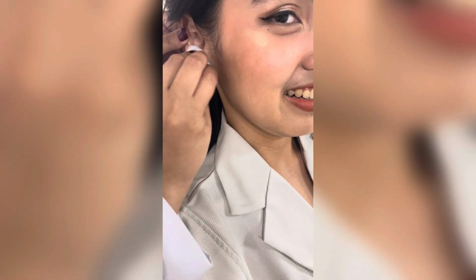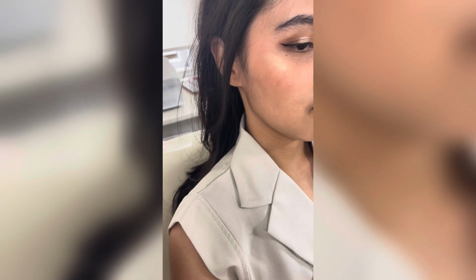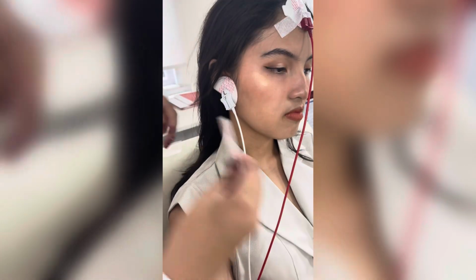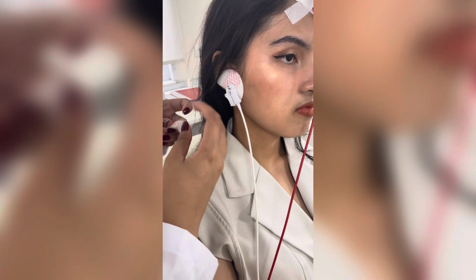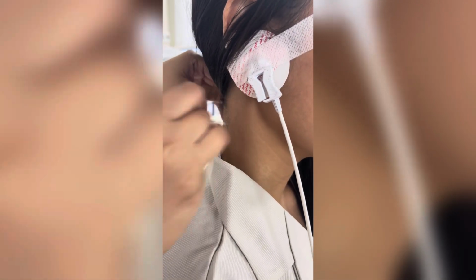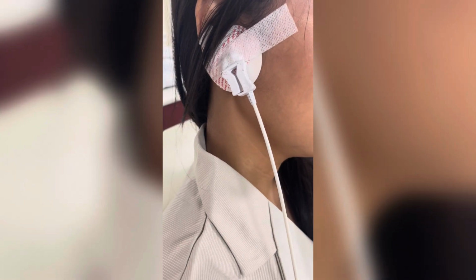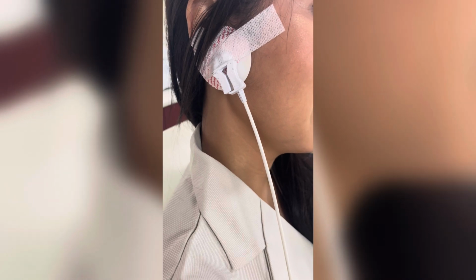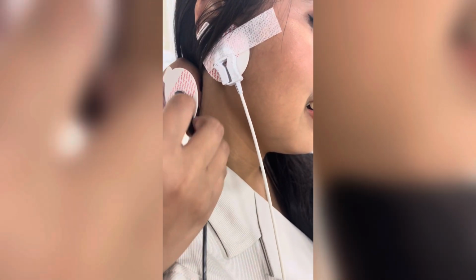And then the location of the second electrode, which is the reference electrode, the white one, is going to be placed on the underside of the earlobe of the patient. Then we're going to stick it again with the sticky adhesive, and fixate it with medical tape once more. And then the last electrode, which is the ground electrode, will be put on a muscle of the neck that is not innervated by the nerves or other parts.